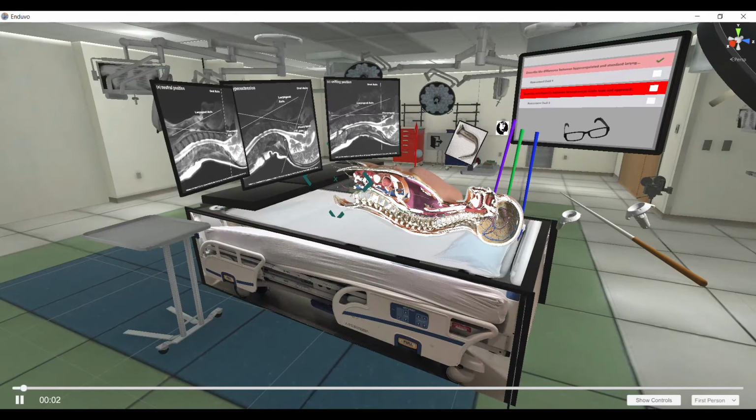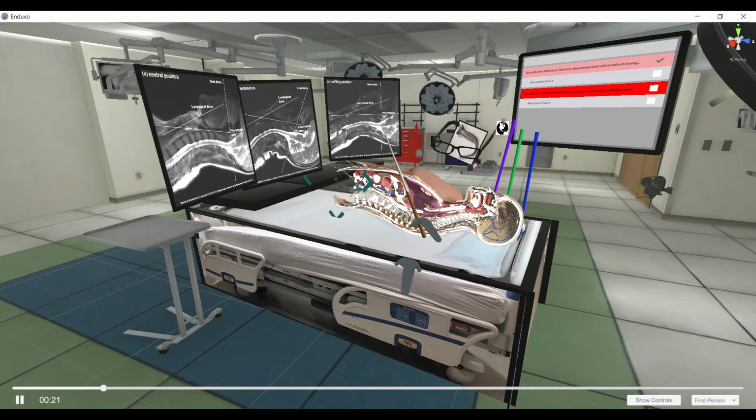All right, for the second portion of this lesson, we're going to focus on the various different airway axes and how your approach to these axes changes depending on whether you're performing direct laryngoscopy or hyperangulated video laryngoscopy. So I'll direct your attention to these three pictures here. And these MRI images basically demonstrate the three different airway axes and how the alignment of these axes changes with different patient positions.